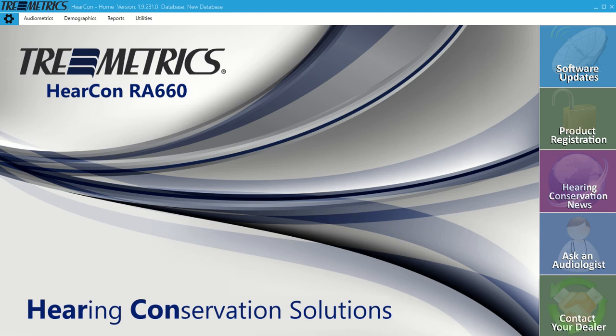So once again, right now we're at the launch screen, so when you first fire up the software, this will be what you're looking at.